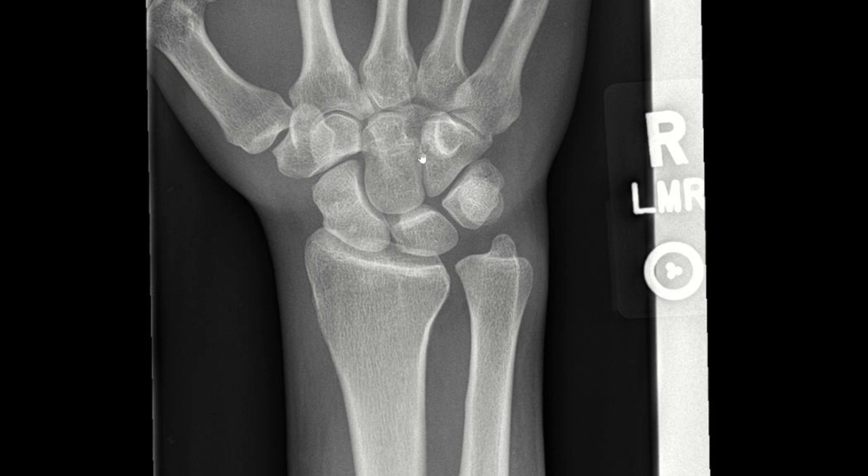Initially this looks like a fairly normal radiograph. Looking closely at the carpal bones in the AP view, we can't really visualize any discontinuities. But like they say, one view is no view.